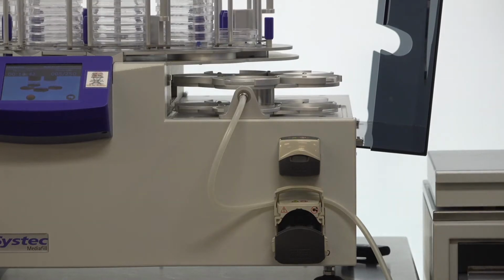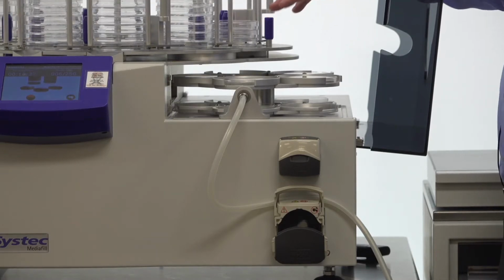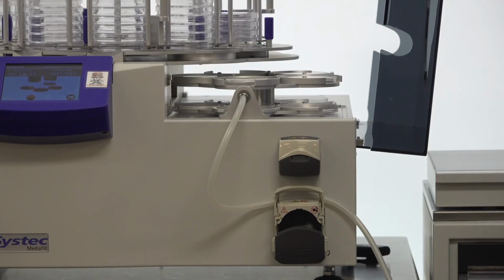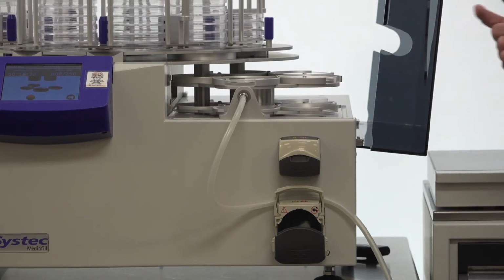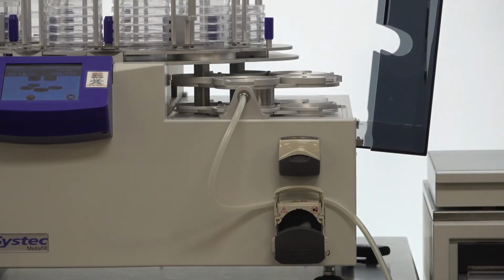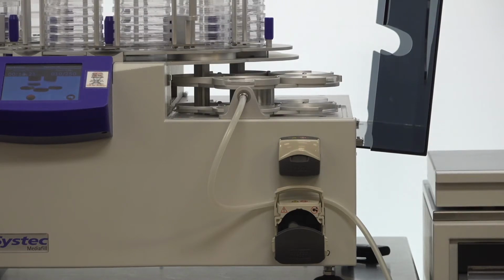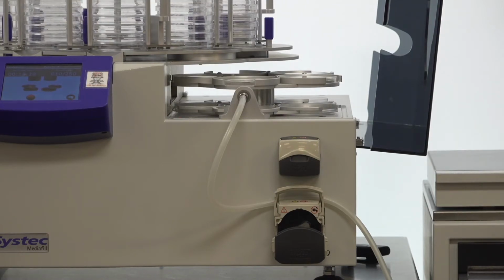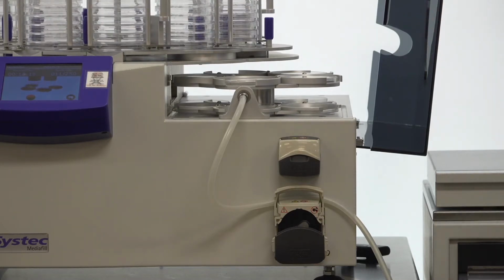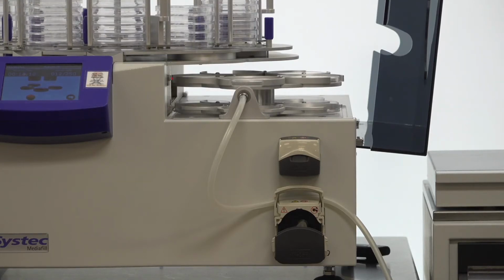Now this filling chamber, normally this lid would be closed, is going to be completely bathed in UV light during the entire filling process until the plate is restacked into the system. You'll notice that these plates, the way that they're shuttling through, we don't have any type of gripper, or the whole stack of plates is not weighted down where it has to remove one plate each time. So it's a very quiet operating system and very smooth operation for shuttling the plates through.